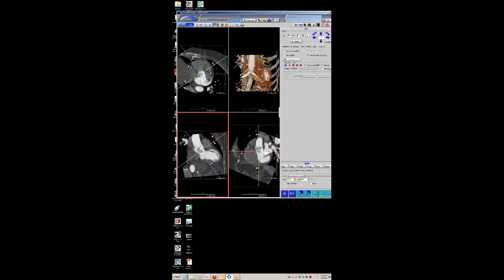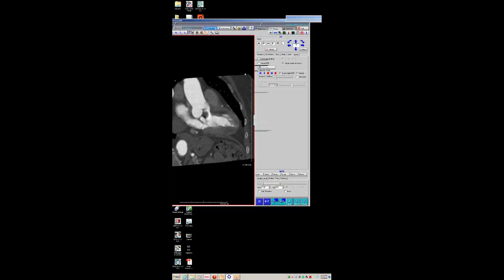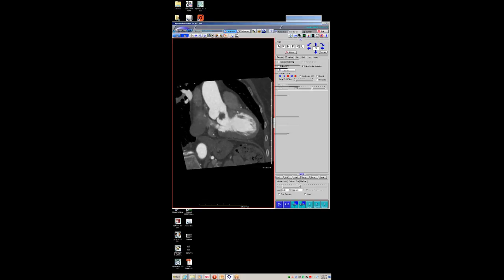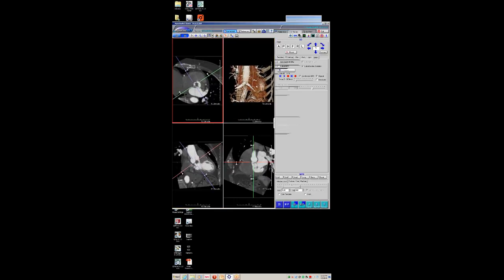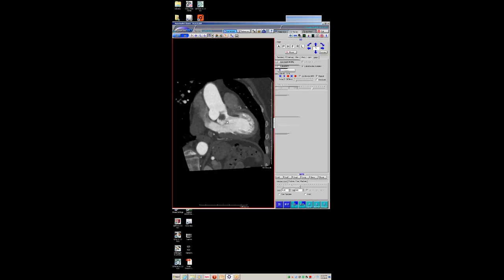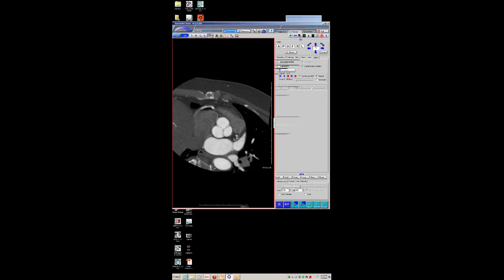This is not a clinical conundrum, but just a nice example. This person has a known lesion on her aortic valve; it's been there for years. Surprisingly they've been following it — she refuses surgery. You can see there is this hypoattenuating mass attached to the aortic valve. It almost appears frond-like. There's very little in the differential diagnosis here — it's either going to be a vegetation, which it doesn't look like, or a fibroelastoma. And she went to surgery, they took it out, and it is a fibroelastoma.